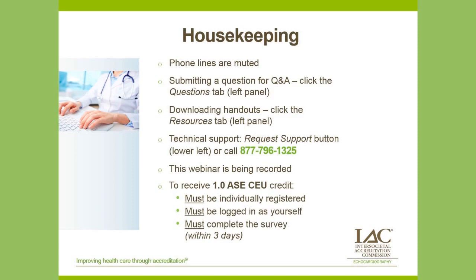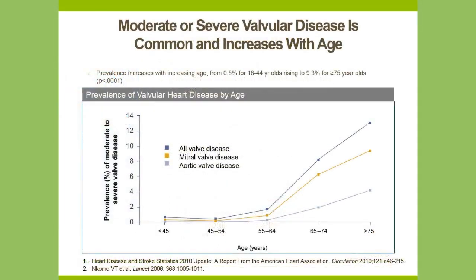Thanks, Kelly. Okay, so let me just advance here. We're going to talk about the reason why it's important to assess the mechanism of MR. And actually, it starts with the fact that MR is pretty common. This slide shows you here aortic stenosis on this bottom gray line. This is the prevalence of aortic stenosis in a bunch of epidemiological studies. And then in the gold, you see mitral regurgitation, which is much more common than aortic valve disease.